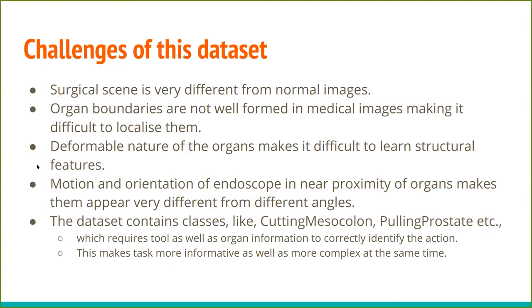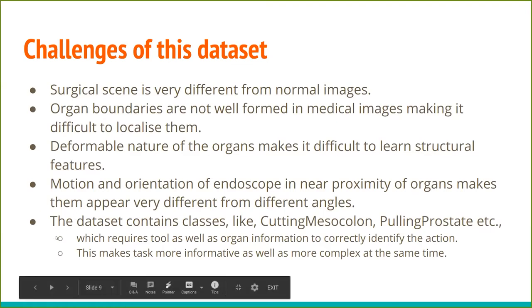Another problem is the deformation. The organs are deformable, and during the surgery, organs change a lot in shape as well as in looks, and that makes it very hard to learn the structural features that can be uniformly used throughout. Another challenge that comes with detection in medical images is the motion of the endoscope camera. The endoscope camera is in very close proximity during the prostatectomy, and when the camera moves, the appearance of the organs changes a lot, and that again adds to the complexity of the problem.